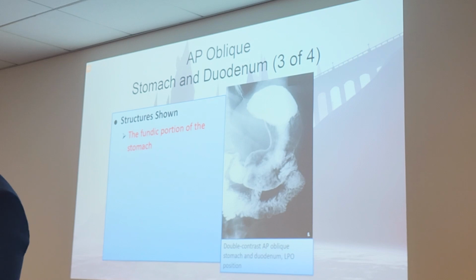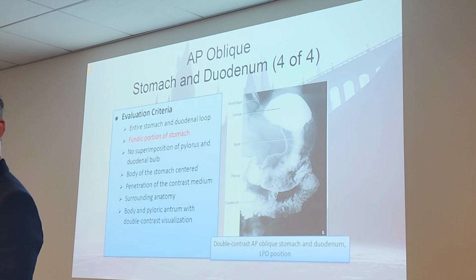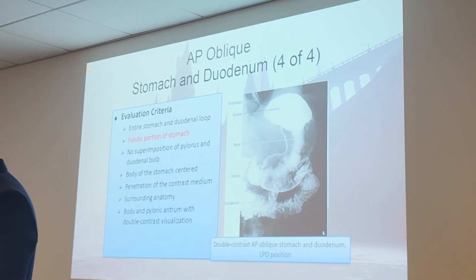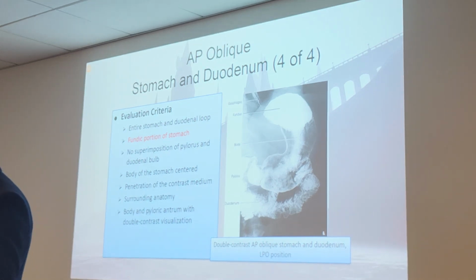This one's primarily to see the fundus in a better view. Barium's in the fundus, air's in the body and pylorus. You use it primarily to see what? The fundus. And that's what it says right there for evaluation criteria. We're interested mostly in the fundic portion of the stomach. That's the main point of that exam. Make it as simple as possible for you guys. I know it's a lot, but I'm trying to simplify it down for you.